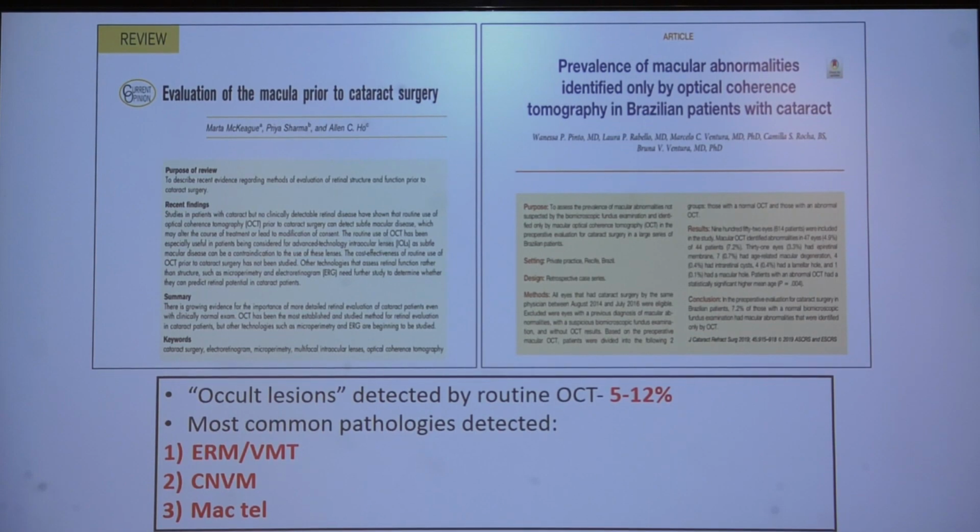for people who do the most common surgery done worldwide, which is cataract surgery. You have lots of papers; I've just put up 2 there. Proponents of doing routine OCTs prior to all cataract surgery, not just premium IOLs. In different populations, which is important because the fundus pigmentation is different, the OCT has been able to detect occult lesions up to the tune of 5 to 12%, when apparently a clinical exam preoperatively was normal.